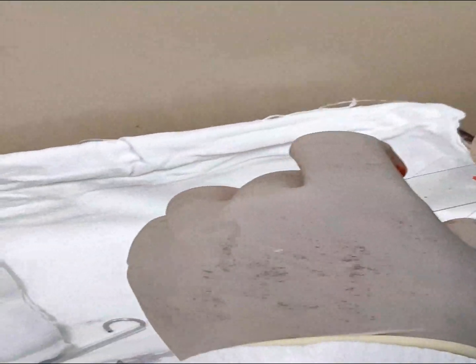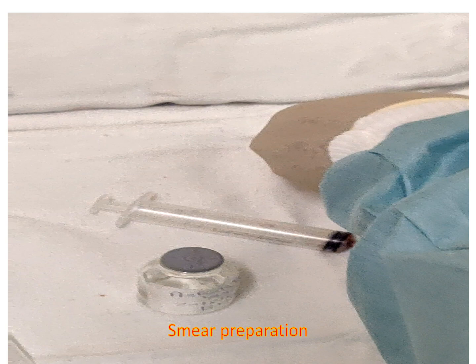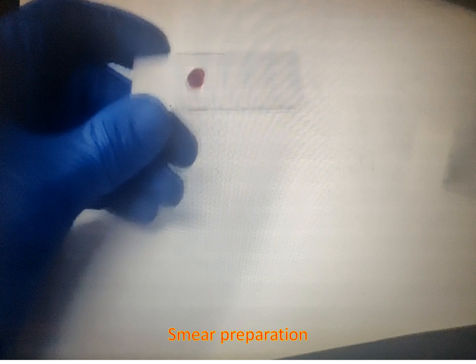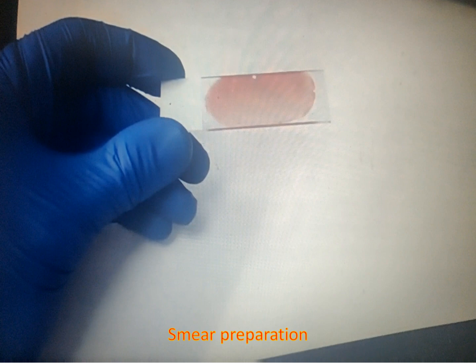Once you have confirmed that the specimen is adequate, put a compressive bandage over the site of the procedure and simultaneously make a touch smear of the bone. To make the touch smear, gently roll the specimen over a clean glass slide. To prepare the smear of bone marrow aspirate, put a drop of aspirate on a clean glass slide, place another clean glass slide over it, and gently pull one over the other. Allow the smear to dry and send it to the respective labs.